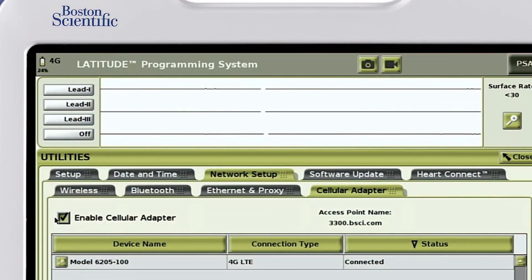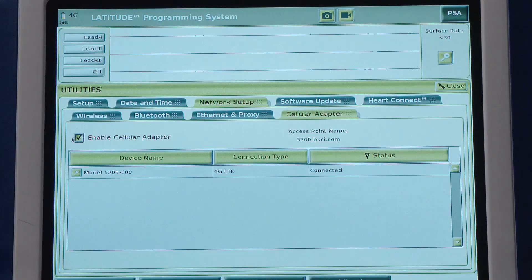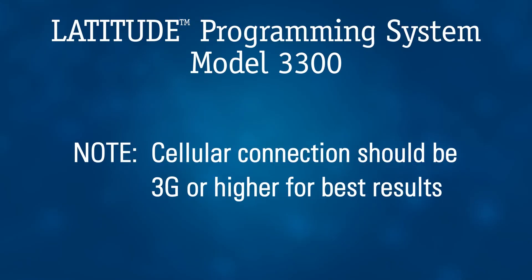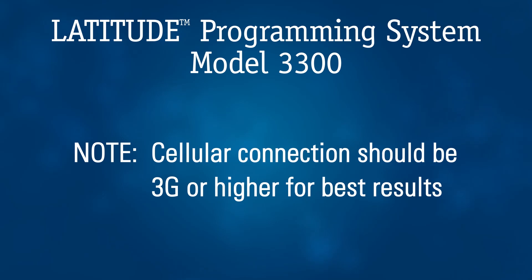The cellular signal strength is shown in the upper left of the programmer screen, and will appear solid once connected. If blinking, the connection is being established. It is important to note that HeartConnect requires a 3G or higher cellular connection. Variations in quality of the cellular signal strength can affect the quality and responsiveness of audio, video, and Model 3300 programmer display information shared in an online meeting.